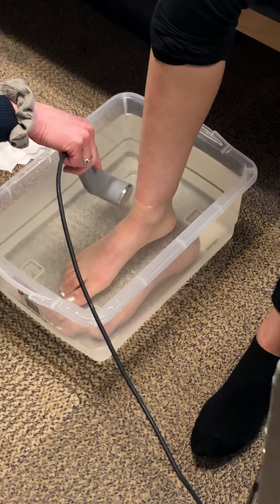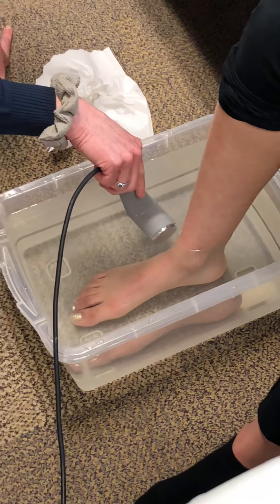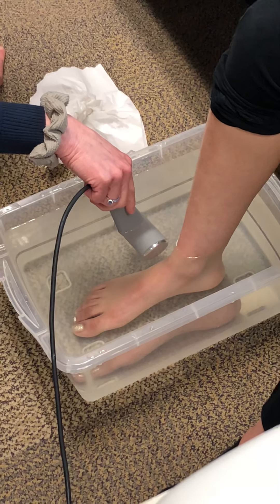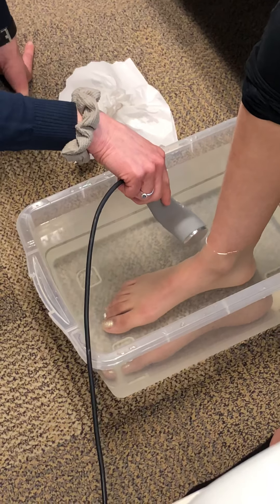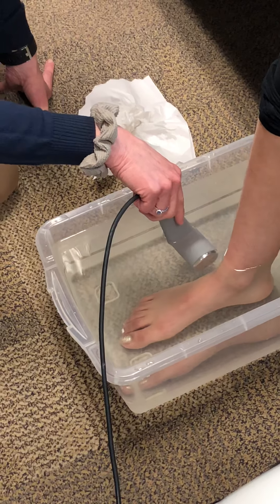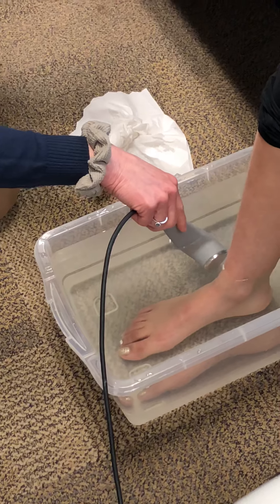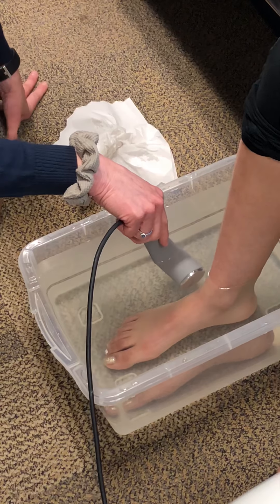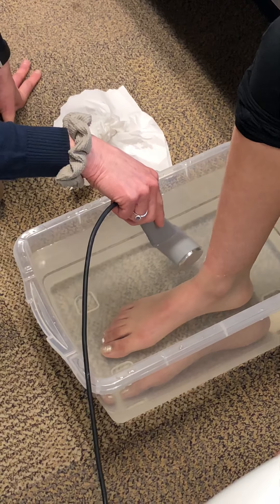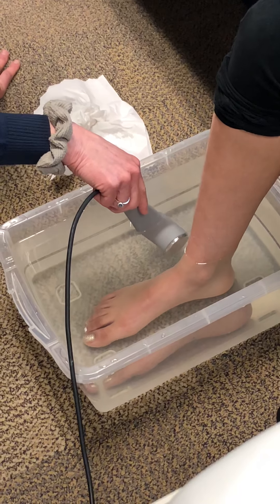Do you see — if I tried to use this big sound head over where the ligament attaches to the bone, I'm not going to have good contact at all. So this is a way you can do ultrasound treatment even for a hand. There's no way those fingers are going to have contact with an ultrasound head. That's why doing it underwater works if you feel ultrasound is a good modality for it.